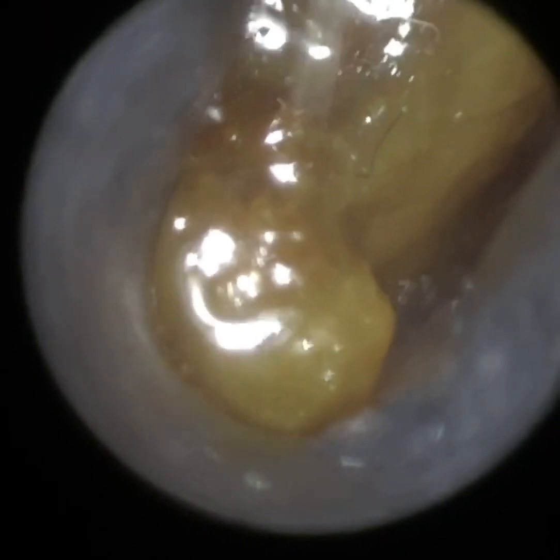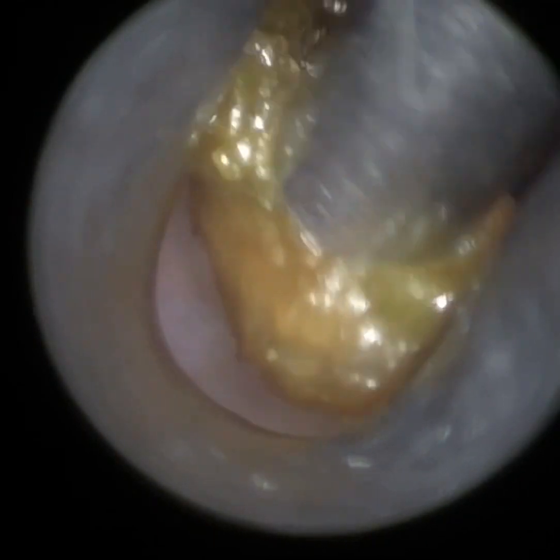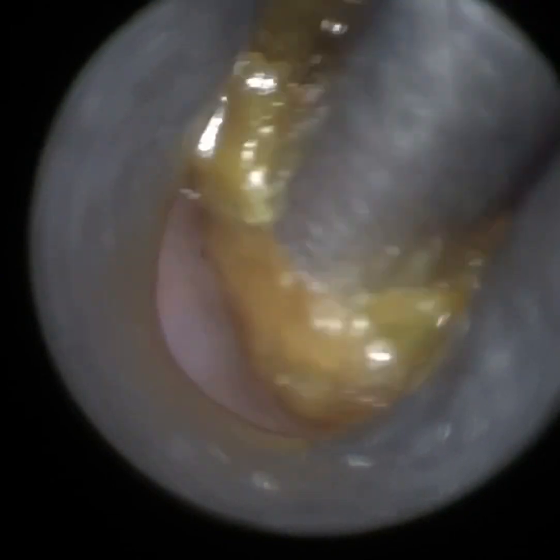The sizes that we have are 3.5mm, which is the one I'm using at the moment, 4.25mm, 5mm, and 5.75mm for the extra large ear canals and mastoid cavities.